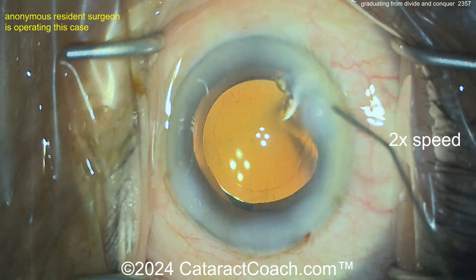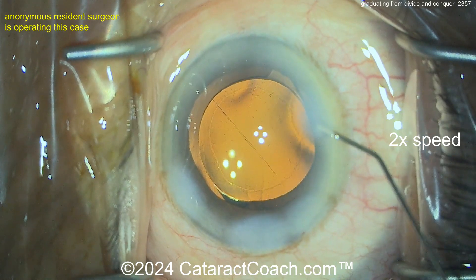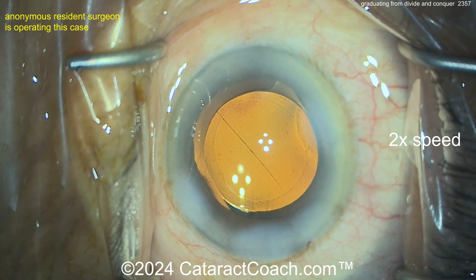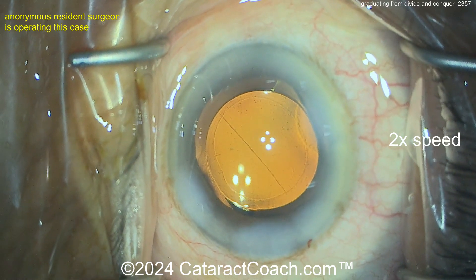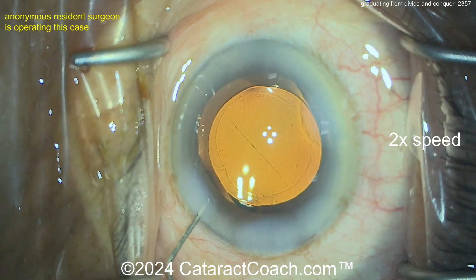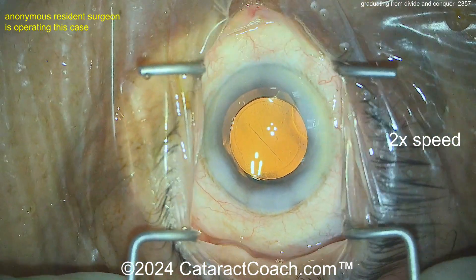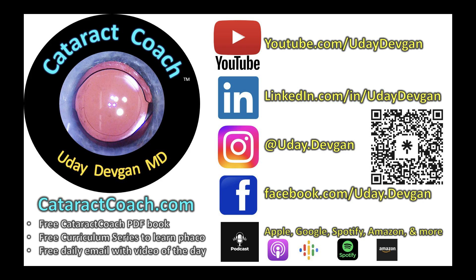It's time to do only stop-and-chop for a while, and then once you're very comfortable with stop-and-chop, I promise you can learn faco chop. I've never met a surgeon who became great at faco chop who said they wanted to go back to divide and conquer. Beautiful case — keep up the good work. And remember, if you're a young doctor who's learning, use cataractcoach.com — great material, all for free.